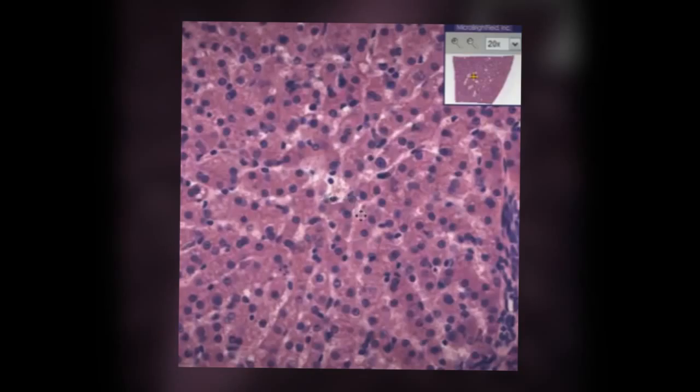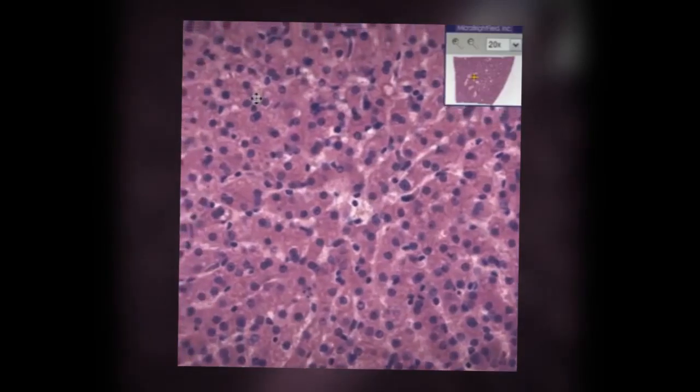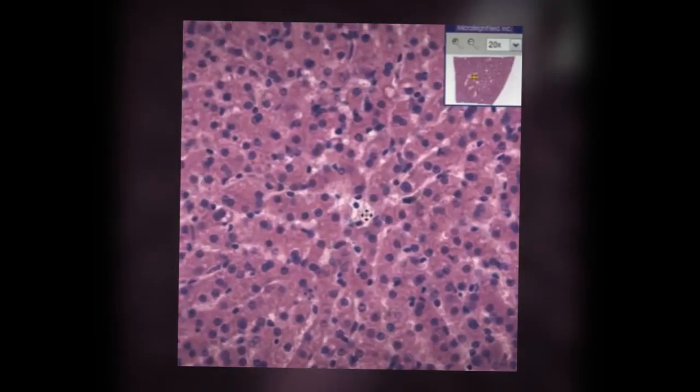They generally have nucleoli. But the cells that are not hepatocytes and are a little more spindly, like here, and possibly here, and probably here, and definitely here, those are the Kupffer cells, part of the reticuloendothelial system. You could call them macrophages or histiocytes because that's what they do. And the nice thing about the liver is that if you take away the portal areas and the big blood vessels, there's only two kinds of cells. The round ones are the hepatocytes, and the spindly ones are the Kupffer cells.